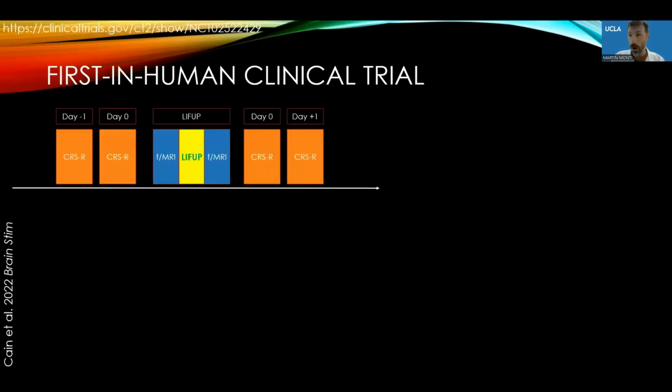Now, a few years ago, we initiated a first-in-human clinical trial. This was the very first example of applying this technology in the clinical context in this manner. And what we did is we recruited both acute and chronic patients in a disorder of consciousness. We did some standard clinical testing on the day before and the day of ultrasound.